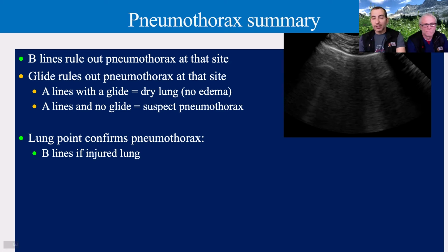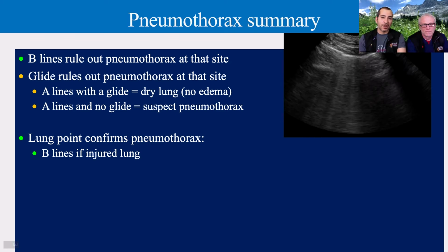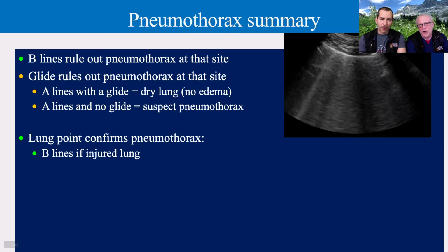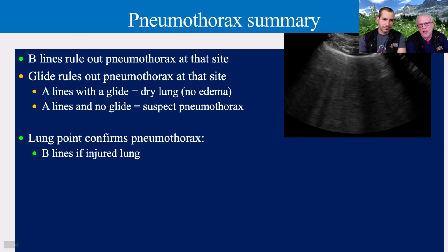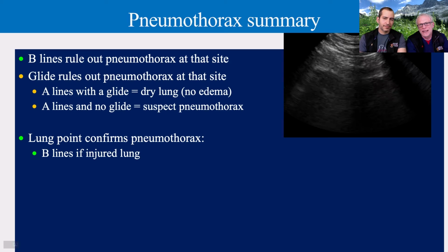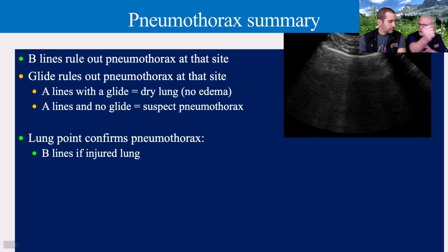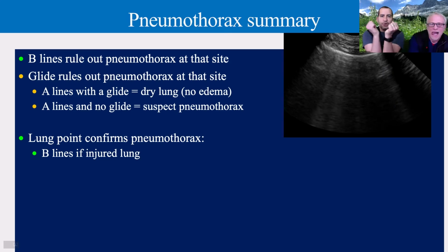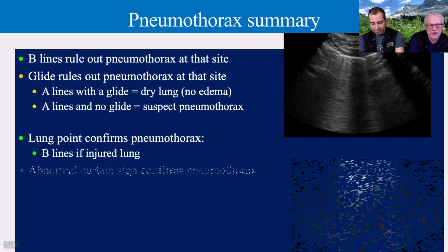And if that lung is injured, coming back in you might see B-lines, like we talked about with that hit-by-car dog. Yeah, we look up here. I can see it's coming in right at the center where my marker is. I see that lung sliding coming in and out. Over here, no lung slide, no lung slide. This is a lung point. Not that typical karate chop up and down, but a central point that comes in for that lung point. Yeah, it's like a double karate chop. Hi-ya! And that actually confirms pneumothorax, Dr. Chalhoub.